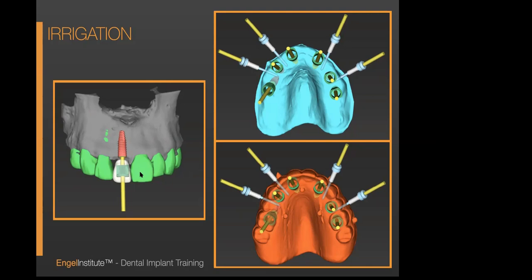But I said, if I can do a veneer on this tooth, I can slenderize it a little and give space to this tooth and make it even. And that's exactly why I did this case guided. Not because I didn't have enough bone, not because I didn't have enough tissue. Contrary to that, you're gonna see it was great.